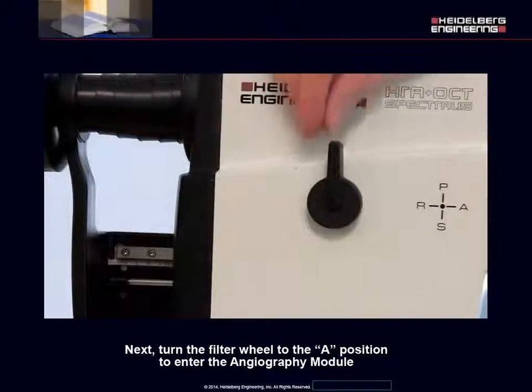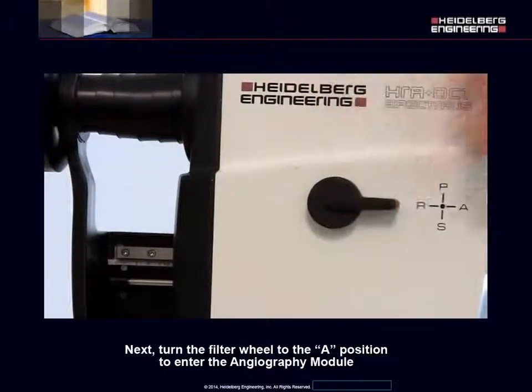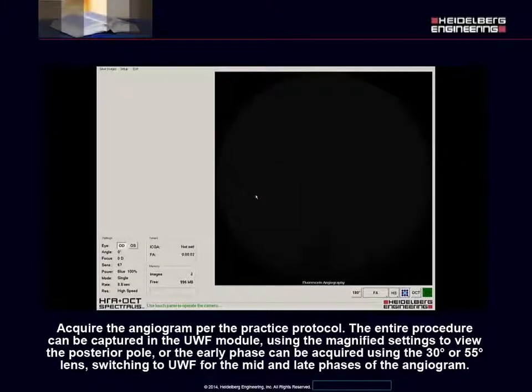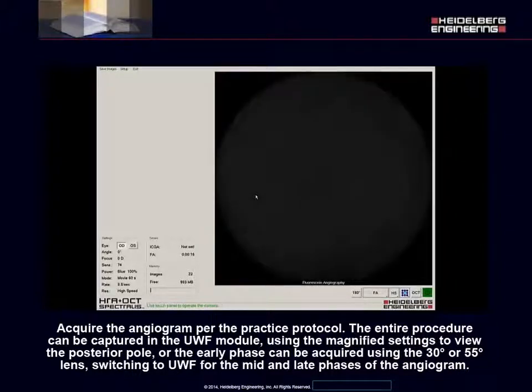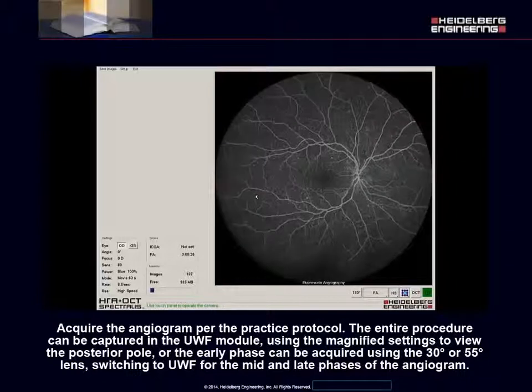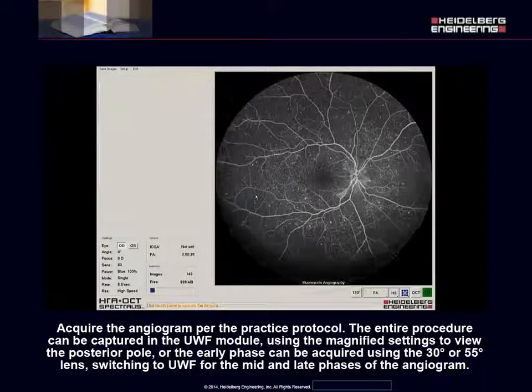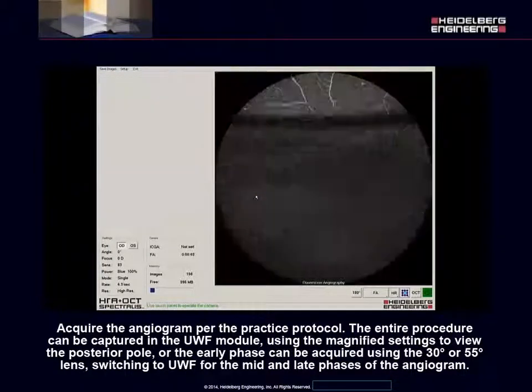Next, turn the filter wheel to the A position to enter the angiography module. Acquire the angiogram per the practice protocol. The entire procedure can be captured in the Ultra Wide-Field module using the magnified settings to view the posterior pole. Or, the early phase can be acquired using the 30 or 55 degree lens, switching to Ultra Wide-Field for the mid and late phases of the angiogram.